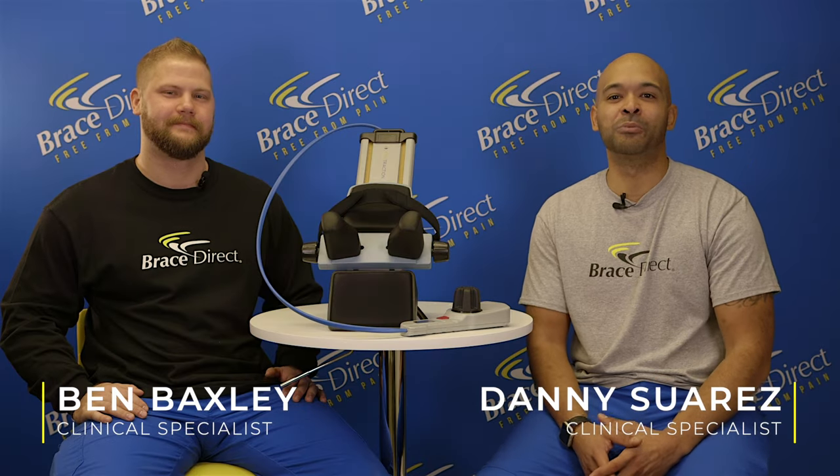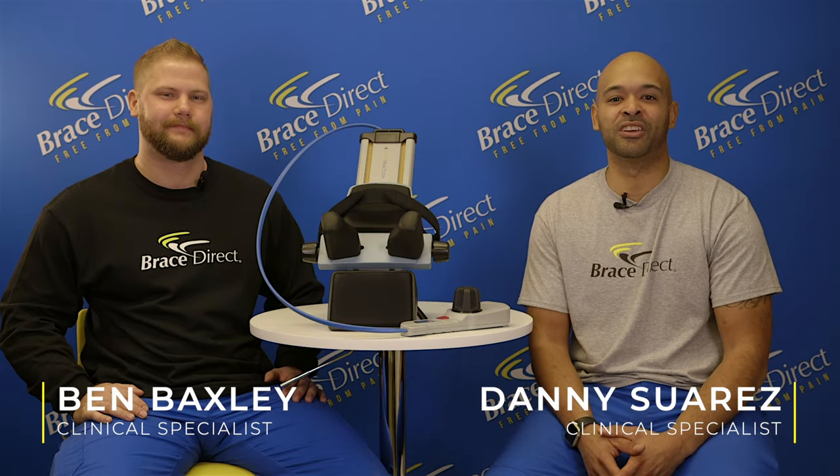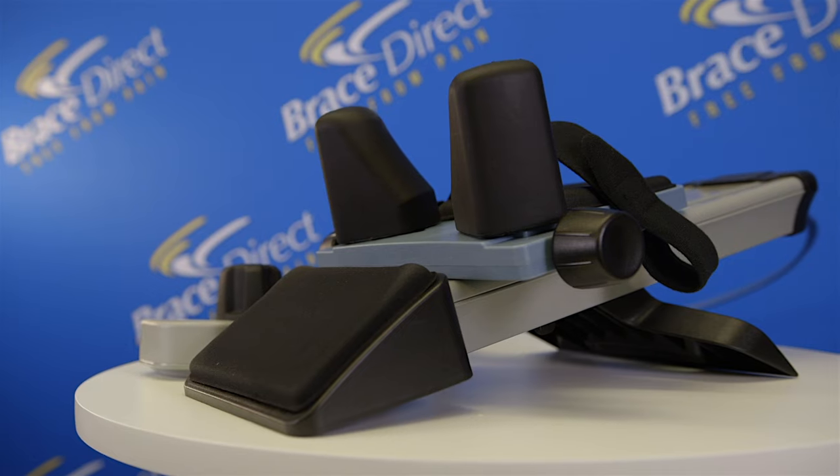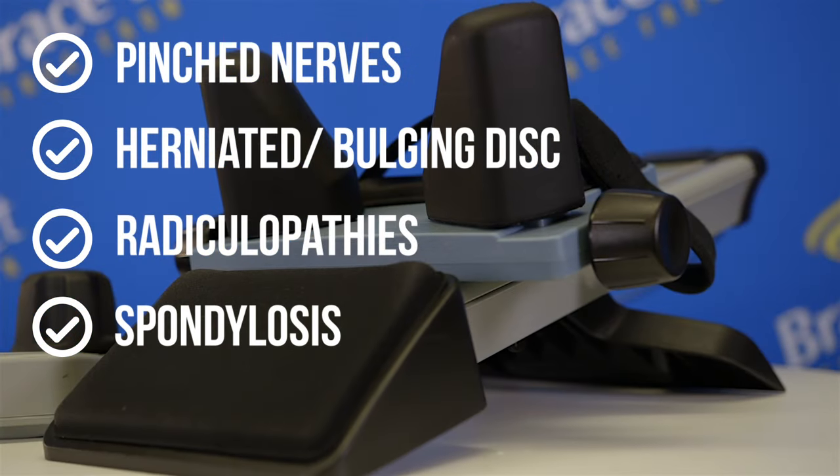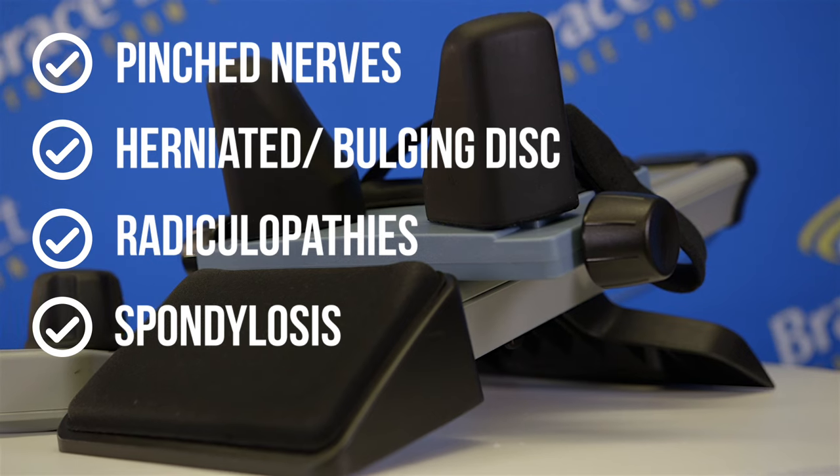Thank you for choosing BraceDirect's Cervical Traction to help relieve your cervical pain. The cervical traction unit will help to relieve pain from pinched nerves, herniated or bulging discs, radiculopathies, spondylosis, and more.